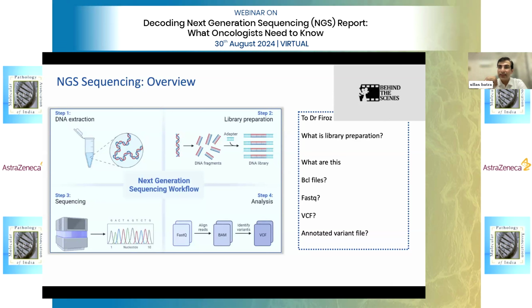So if I analyze a report and you analyze a report, Dr. Suruchi analyzes a report, Dr. Feroz analyzes a report, Dr. Vindhya, how much is the chance of inter-observer variability? Dr. Minu? Yes, sir. Actually, this is compared with the human genome, so the chance of variability is little because it is compared base to base, and according to that, the variants are called. Okay. Fantastic.